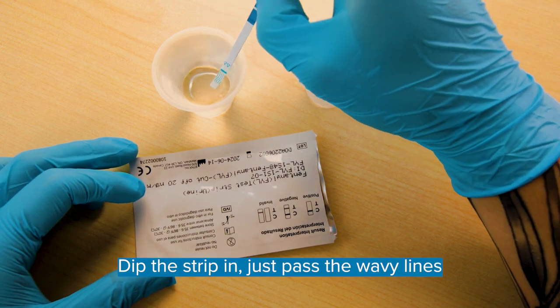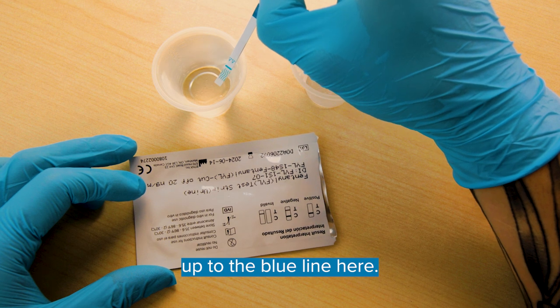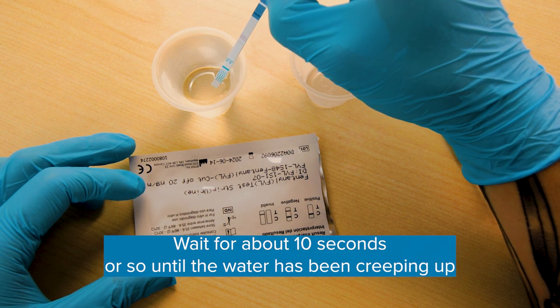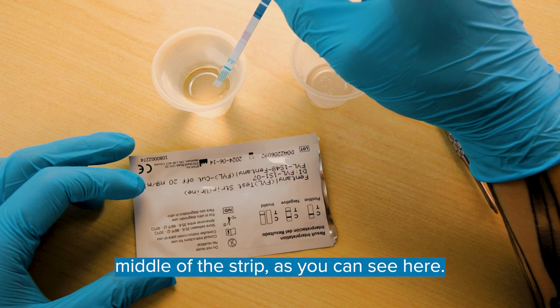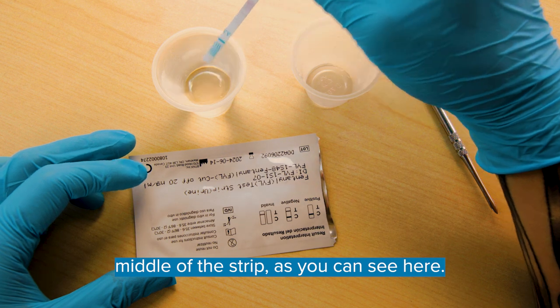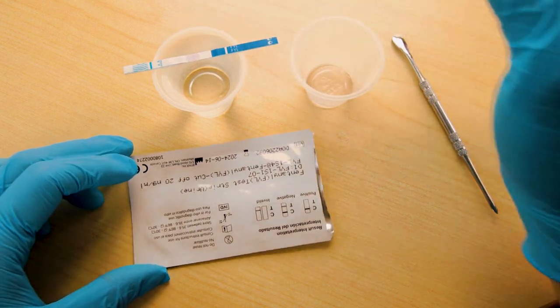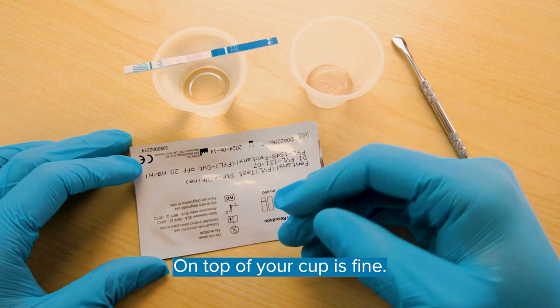When you're ready, dip the strip in just past the wavy lines up to the blue line here. Wait for about 10 seconds or so until the water has been creeping up the middle of the strip, as you can see here. Once that happens, you can set the strip down somewhere it's not going to contaminate a surface — on top of your cup is fine.